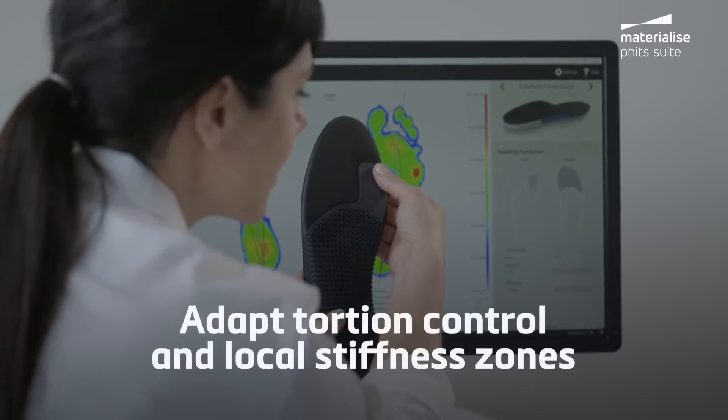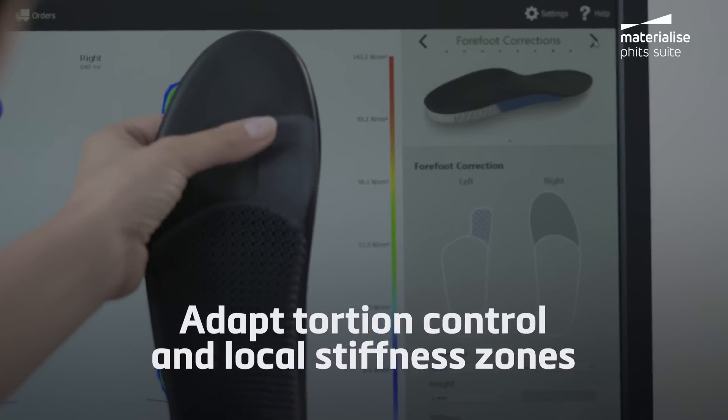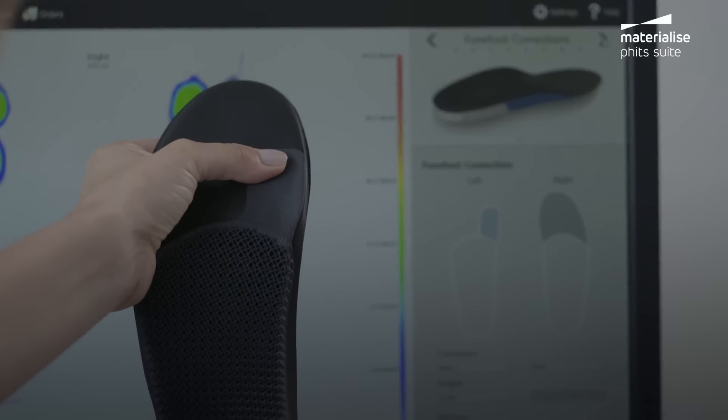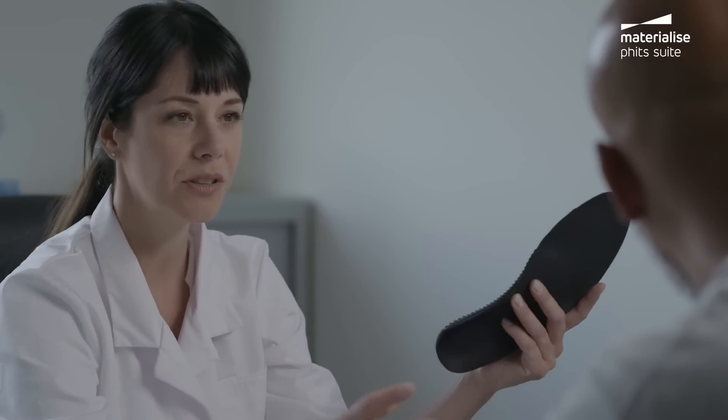Then build, design, and modify the perfect custom orthotics with the freedom to adapt torsion control and local stiffness zones like never before. All guided by an intuitive design wizard and objective, quantifiable data.